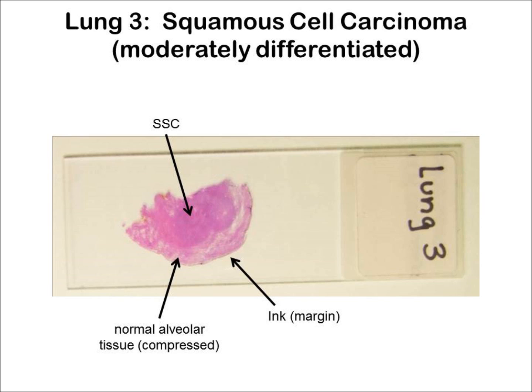The outer region consists of collapsed alveolar tissue, while the inner darker staining core contains a mixture of tumor cells and normal connective tissue. No cartilage is apparent, suggesting that the tissue was taken from a more peripheral region of the lungs. In addition, there are small nodules of lymphoid cells scattered throughout the tumor mass.